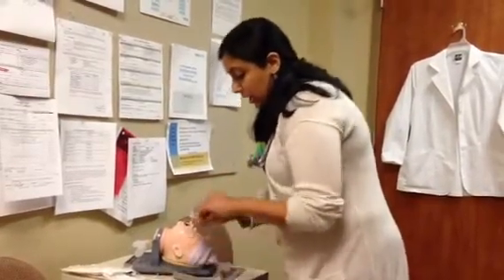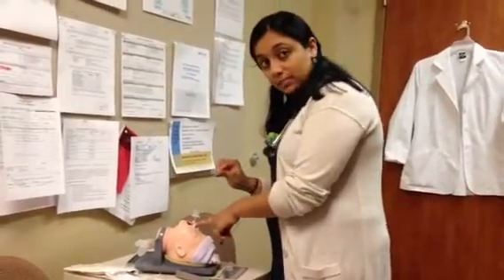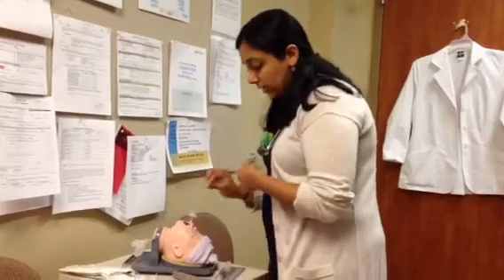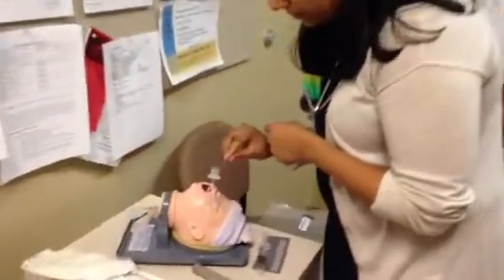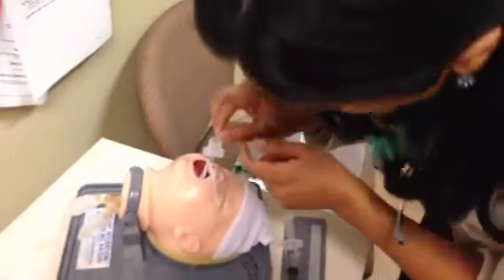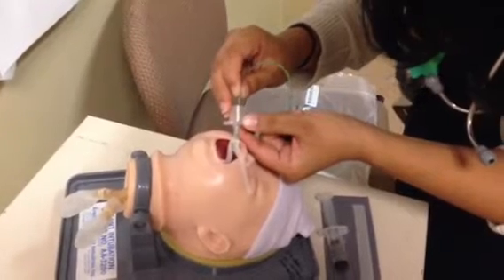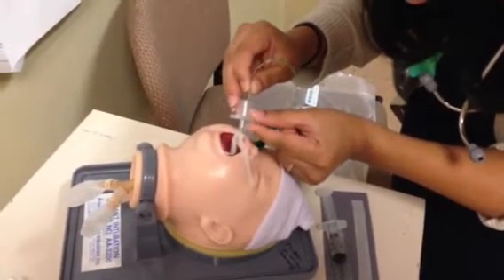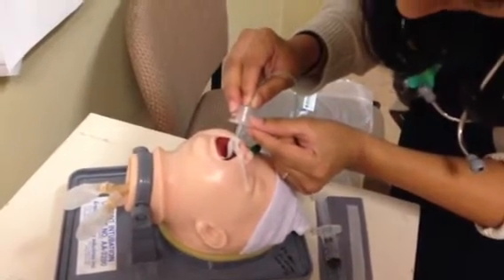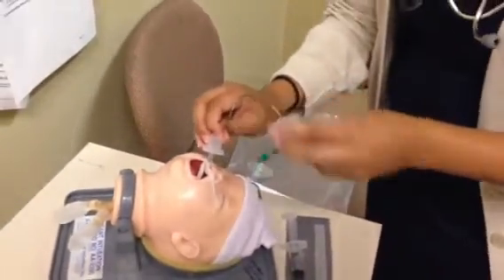Next thing we're going to do is you take the needle off the syringe, and you're going to insert your NG. So like I said, this infant was taped at 10 centimeters at the lip, so you're going to insert the NG to a depth of 9. We're using a 5 French NG tube. So you can see the numbers of the NG tube through the ET tube. So 9 is currently right here. So I'm going to advance the 9 to the lip. Then we're going to hold the NG tube in place right here.